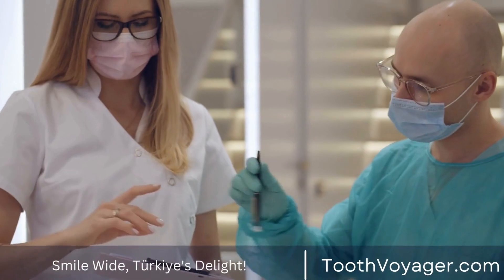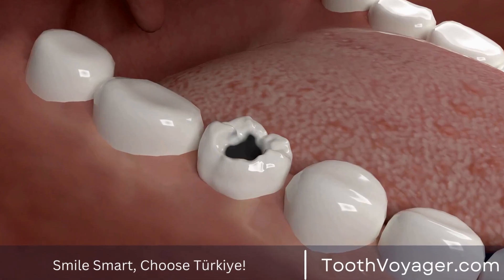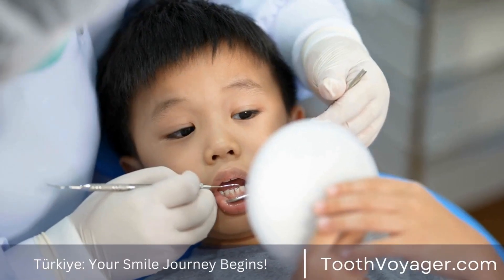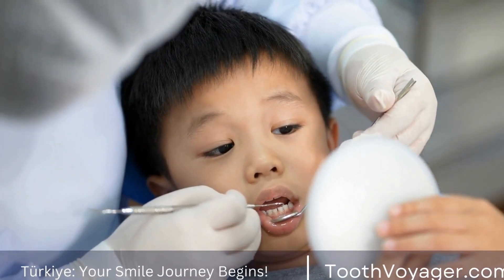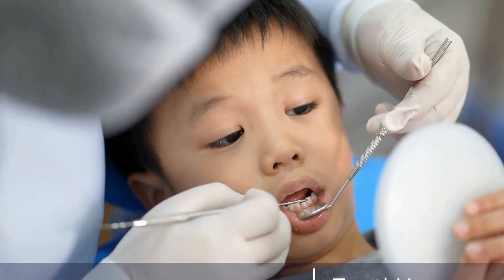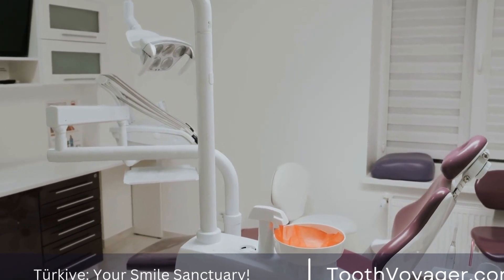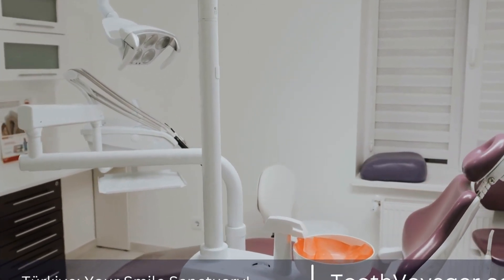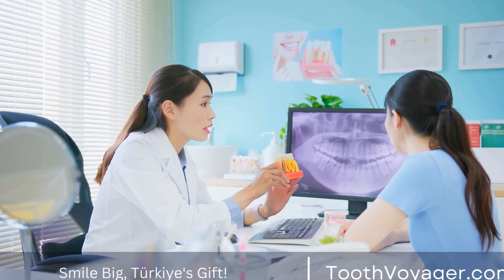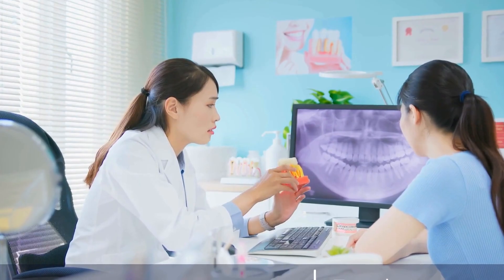2. Preparation for Dental Crowns. The first step in crafting a dental crown is to prepare the tooth. This involves removing any decay or damage and reshaping the tooth to create a secure foundation for the crown. In some cases, a root canal may be necessary to remove infected pulp and strengthen the tooth. Once the tooth is prepared, an impression is taken to create a custom-fitted crown that matches the shape and size of the tooth.